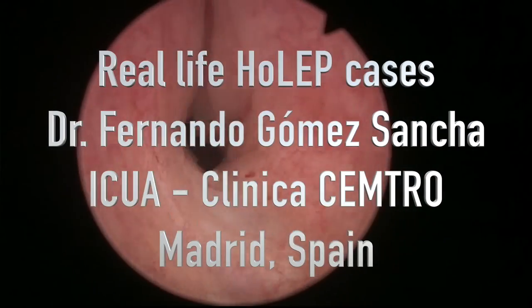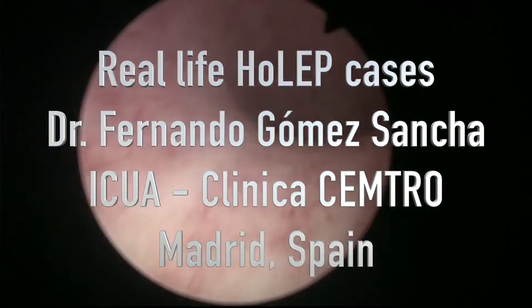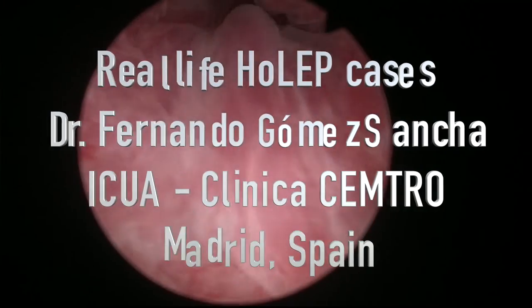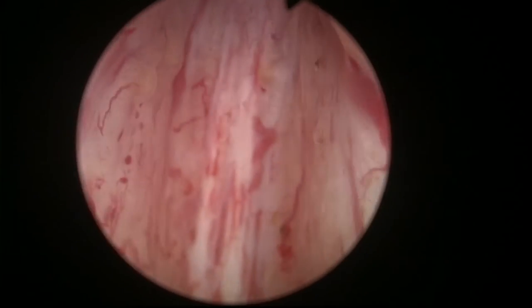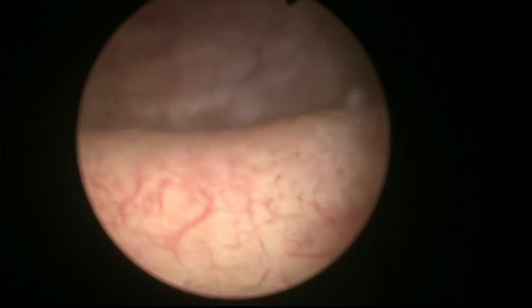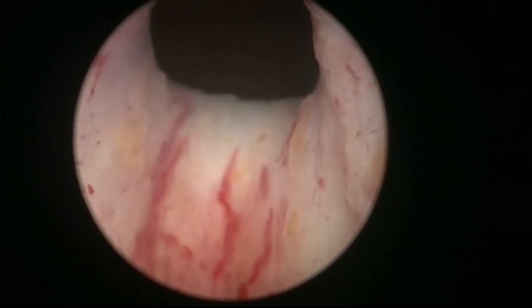Hello, this is Fernando Gomez Sancha. This video was recorded last week and for some reason the audio was not recorded in the operating room, but I decided to work on the video because it was a nice case showing very interesting and valuable information for those of you who are learning to do HoLEP. It's a mid-sized prostate with an elevated bladder neck, and the case was particularly favorable in terms of good visibility, giving it high didactic value.